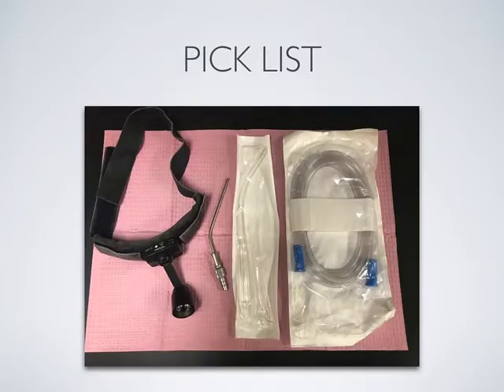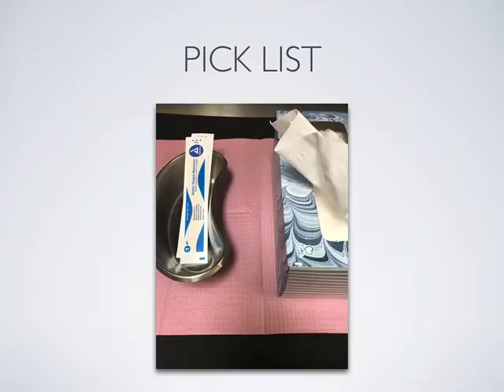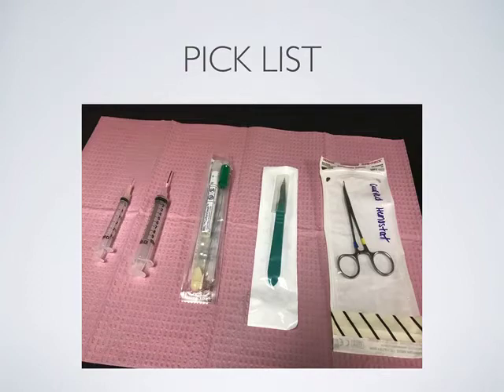Obtain a headlight and ensure there is a suction setup available and functioning with either a Fraser or Yankauer suction tip. You will need tongue depressors, a kidney basin, and tissues. You will also need a 25 gauge or smaller needle on a 3 cc syringe, an 18 gauge needle on a 10 cc syringe, a culture vial to collect the purulent aspirate for culture and sensitivity, an 11-blade scalpel, and a curved hemostat.